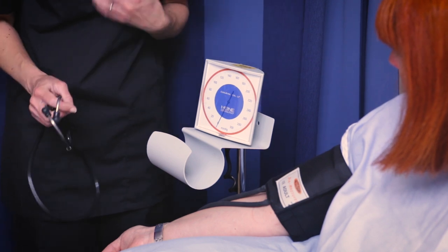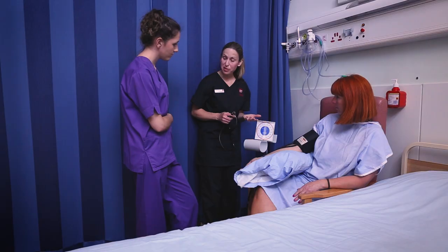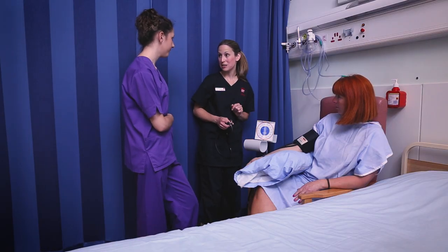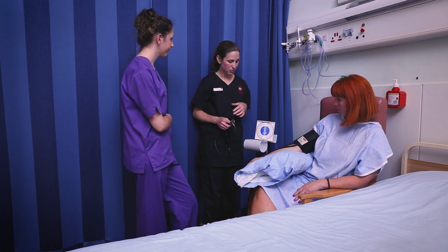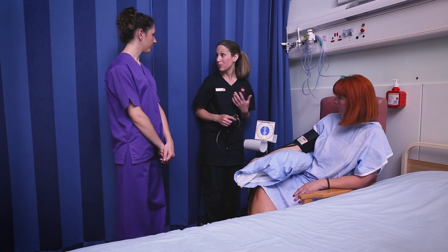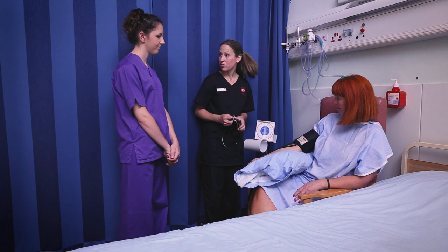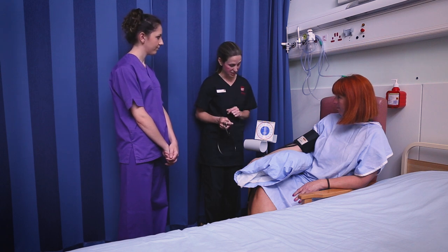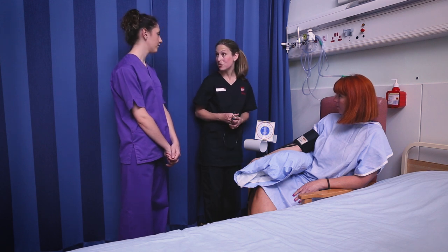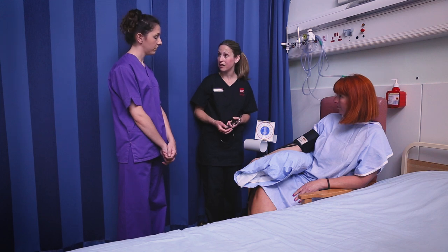After the reading, it's obviously important to document it very carefully in the notes. One thing to say about this procedure is that it's something you need to practice a lot. When you go on your clinical placement, it's really important that you practice on patients, because it's a skill that needs to be mastered — it can be difficult to hear. If you don't get it first time, it's okay to let the patient rest for a few minutes and then try again. Some patients are clearer than others to hear. The NICE guidelines even say it's important for qualified practitioners to practice this technique regularly to maintain their currency.